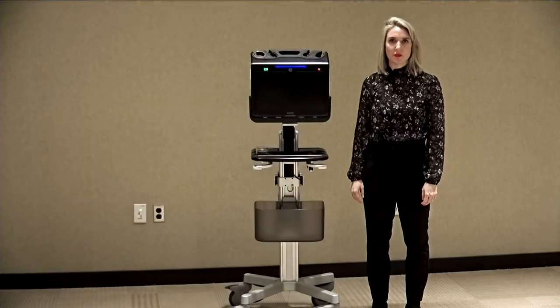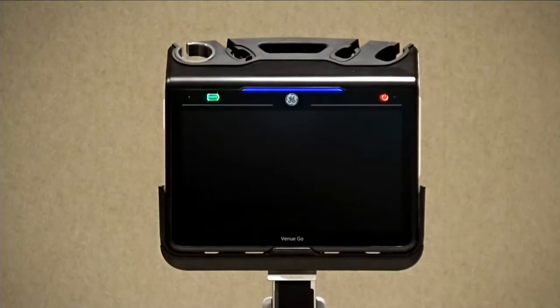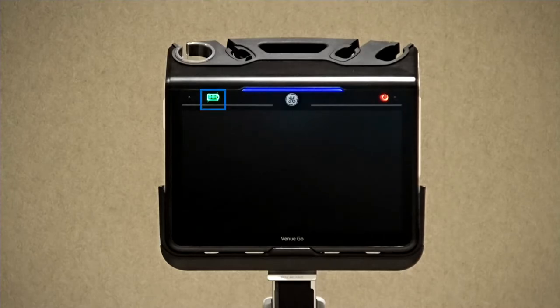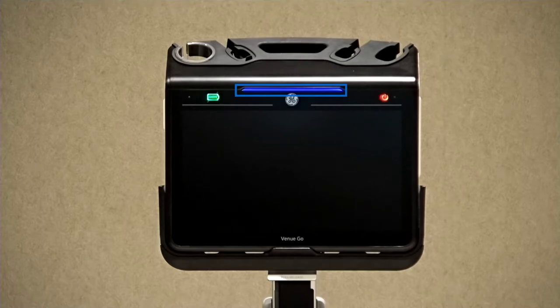The Venue Go has a 15.6 inch monitor. The Venue Go's battery has up to two hours of scanning time, and here you can see two battery indicators that clearly display the remaining scan time: a battery icon and a customizable LED bar.